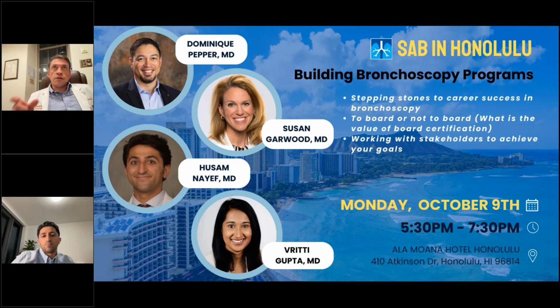You will see a difference in practice. For example, if you look at clinical trials, that is not what they did. In other words, in clinical trials, no one got pleurodesed. In clinical trials, they would leave you on suction, and if you have a prolonged air leak, then they would pull out one of the valves. So what that does, as you may imagine, is that it undoes your procedure. If you pull out one valve or 10 valves, that lobe is going to inflate immediately, and of course then the air leak will stop. But then you've undone your procedure.